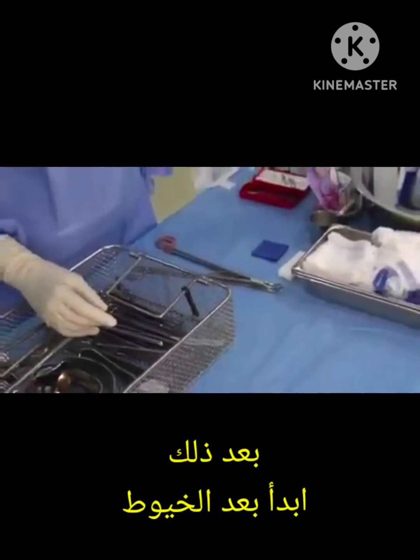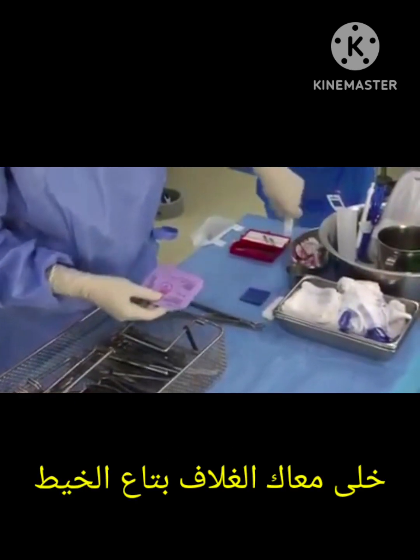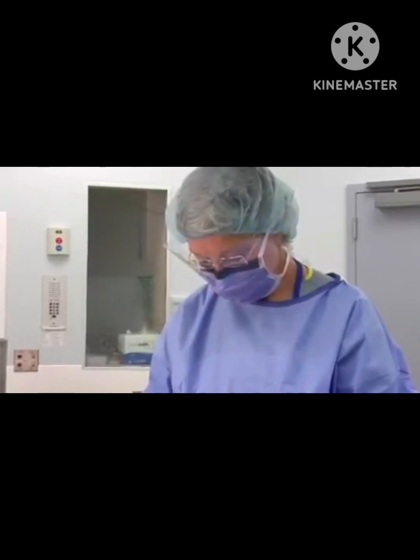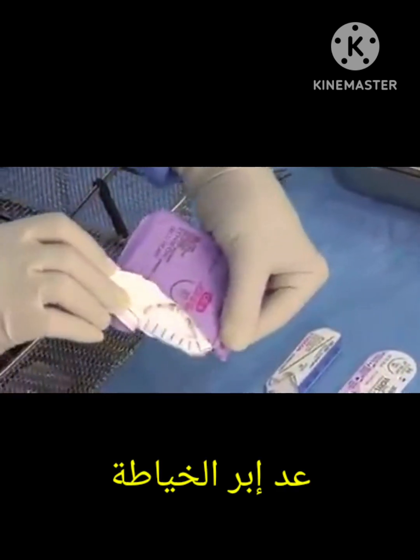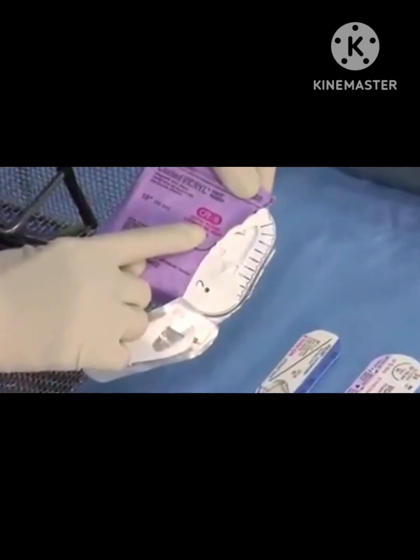Following scalpel blades, count injection needles — all parts must be counted. Next, count the sutures. Pick up the suture packages and lay them out separately on the table, indicating each package as you count it. Check packages carefully for the number of sutures. Some come in multiple packages containing two or more — if this is the case, open the package and display the needles.